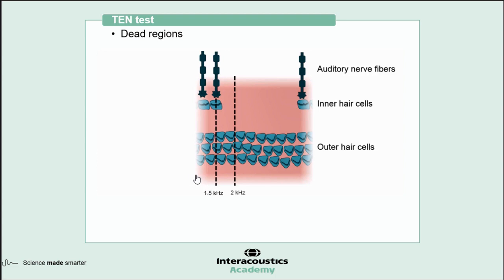So you'll see the traveling wave appear in just a moment. This is for 2 kilohertz, and we can see the spike lines up with the 2 kilohertz where the inner hair cells should be, but where the dead region is. But actually the edge of that traveling wave is being caught by 1.5 kilohertz, which is then being stimulated. So when we're doing pure tone audiometry, we might be presenting 2 kilohertz and recording a response there, but whether that response is truly representative of what 2 kilohertz is doing on the basilar membrane, or whether it's coming from off-frequency listening, isn't immediately apparent.